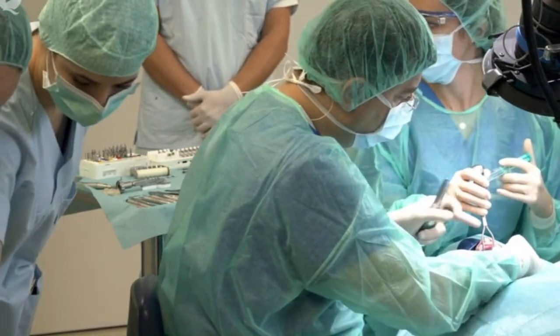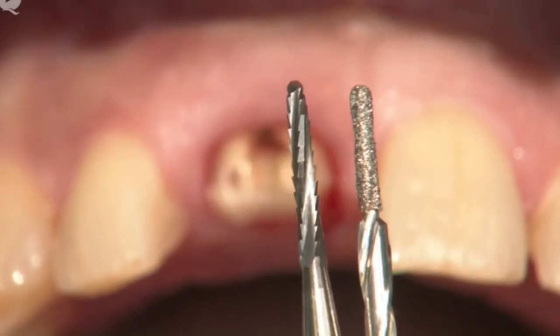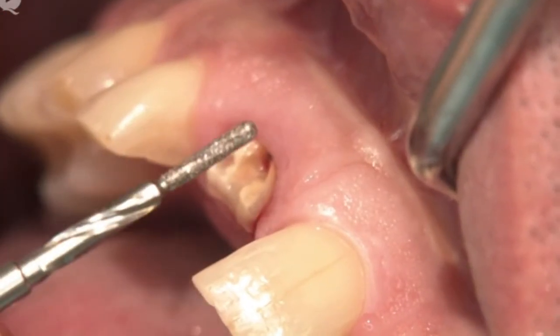This set offers two options. You have the choice between either a diamond coated drill and a very fine Lindemann burr that can be inserted.